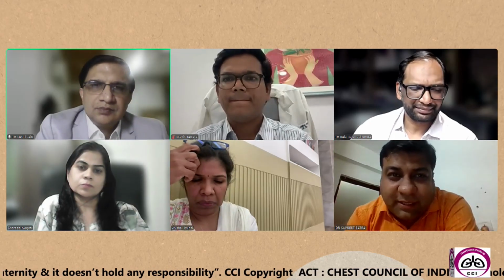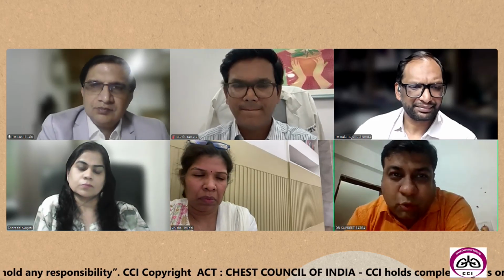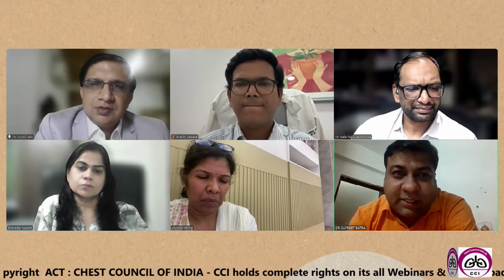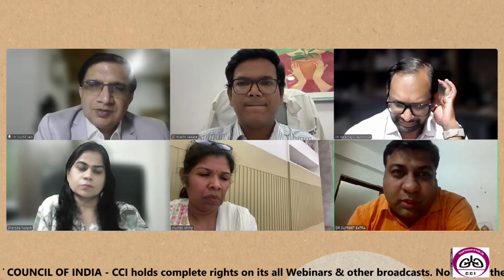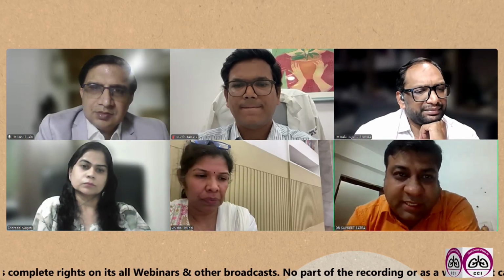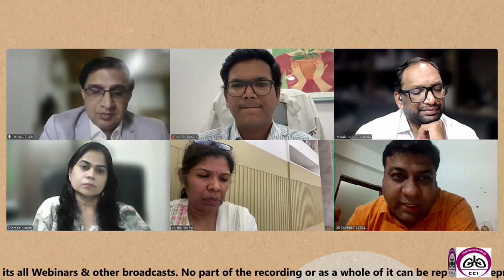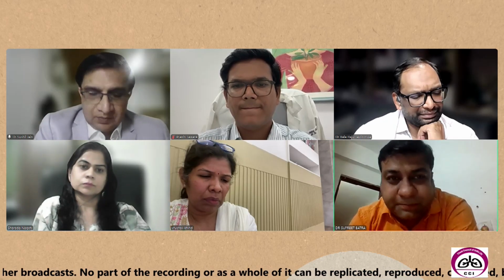But if you have punctured a vessel, then like sir said, SVC syndrome, I had a case of SVC syndrome in which I tried to biopsy for 4 hours and it started bleeding very badly. Okay. Because it was engulfing that. So there are some tricky cases where we have to use a Doppler when the lymph node is near the vessel, keep seeing the needle throughout, do not cross the texture or the boundaries of the lymph node, and keep the jabbing from one end to another end, but keep control over the needle so as to avoid puncturing any vessel nearby.